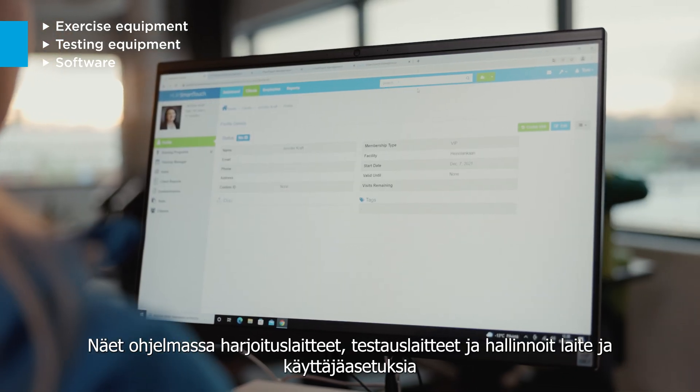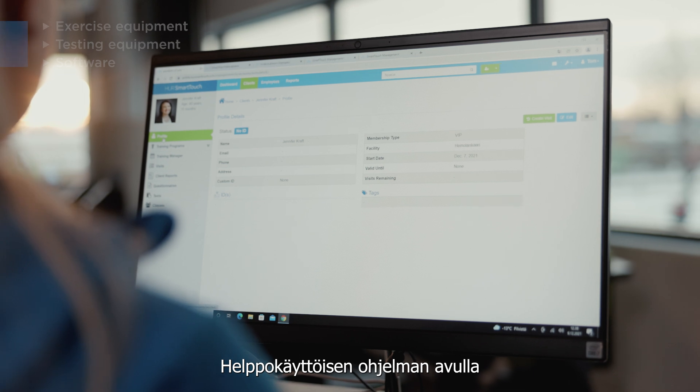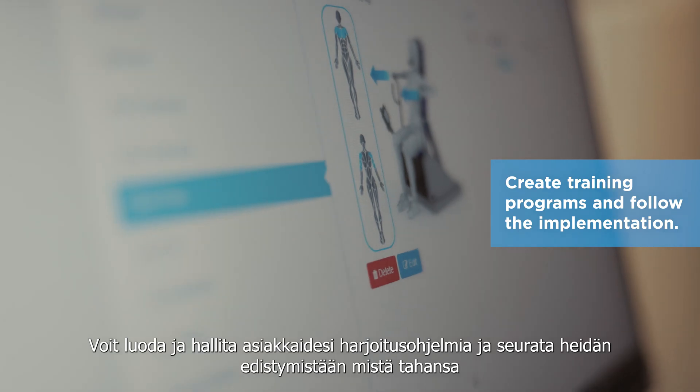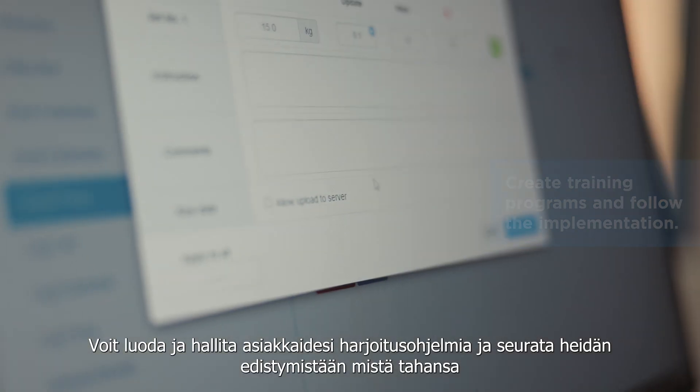HerSmartTouch manages your customers and their exercises. In the easy-to-use web interface you can create and manage your customers' training programs and follow their progress from wherever you are.